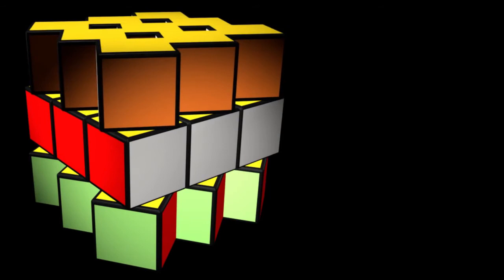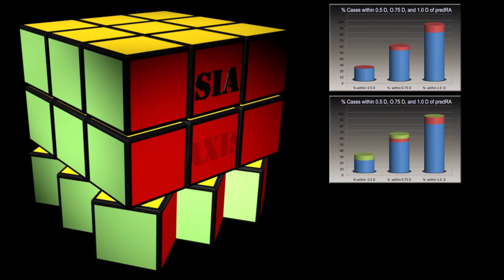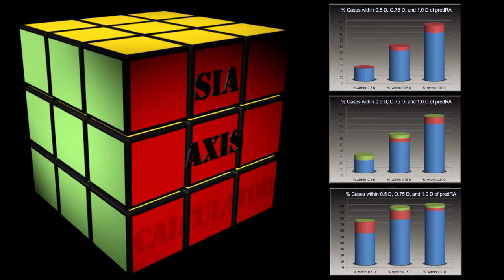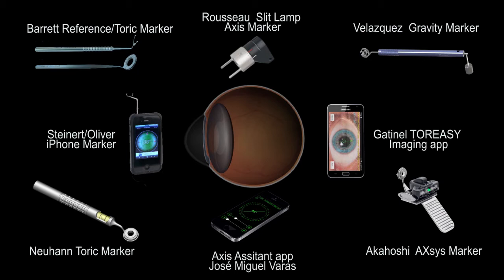Solving the Toric Enigma therefore requires reducing errors in estimating the SIA by using a centroid value and operating on a consistent axis, improving accuracy in Toric IOL alignment, and most importantly, using an improved Toric calculator. There are many handheld instruments currently available, relying on a slit lamp, spirit level, or gravity to define an accurate reference mark at 180 degrees.